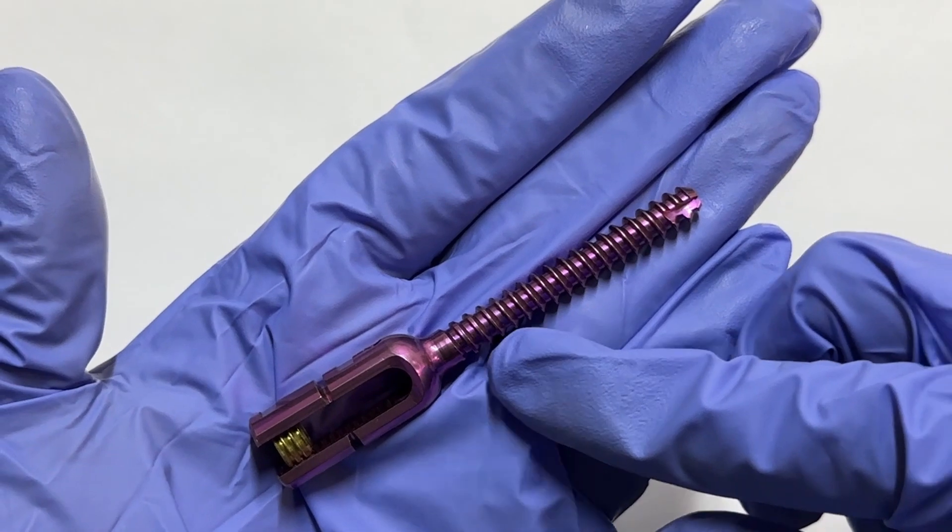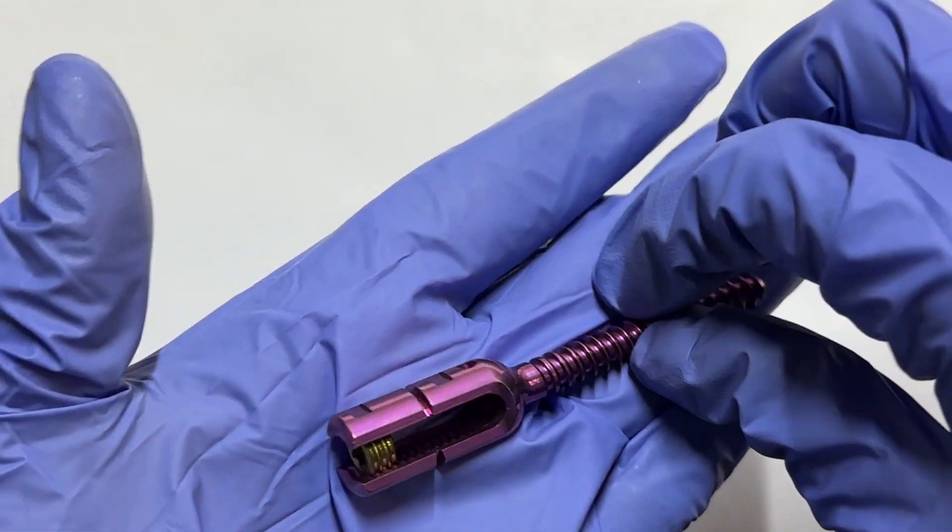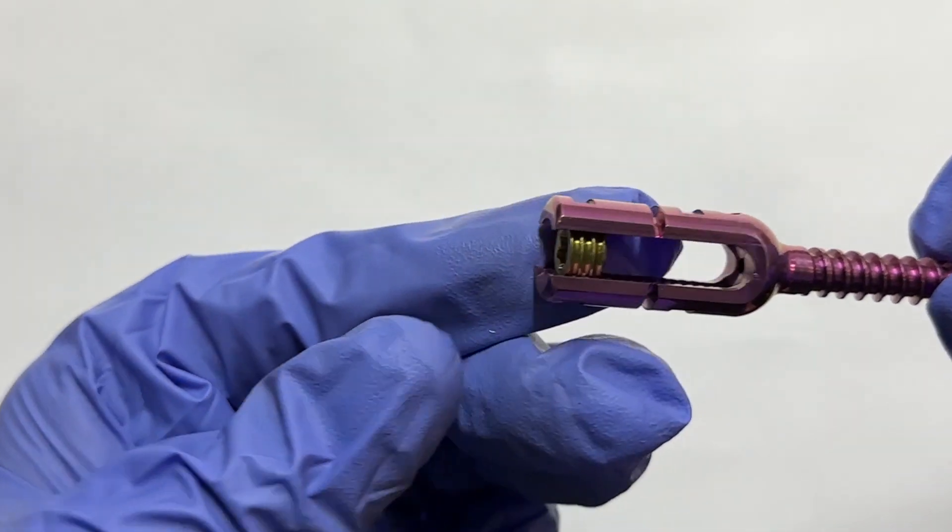Diving into the specifics, there are two distinct types of pedicle screws: monoaxial pedicle screw and polyaxial pedicle screw.